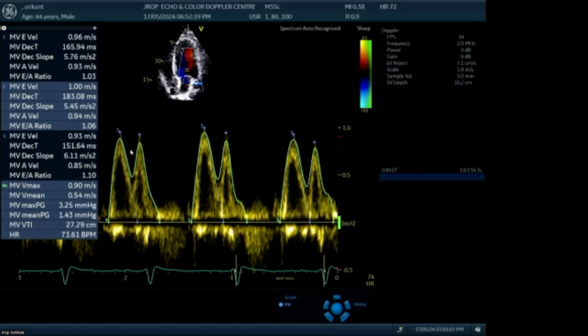And this is a part of diastasis, when the pressures have equalized between LV and LA, that is, the blood is coming from the pulmonary vein and going directly to the LV, which is known as diastasis. And third is when the diastole is about to finish, the atria kicks, the atria contracts. When the atria contracts, that gives rise to the A wave. Okay. Thank you, sir. Right.